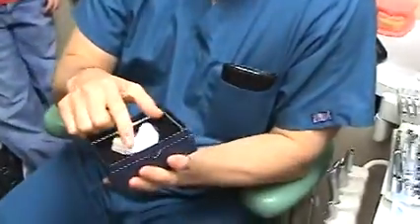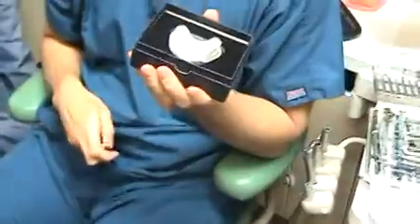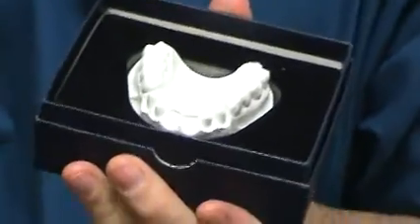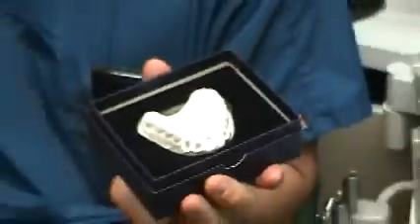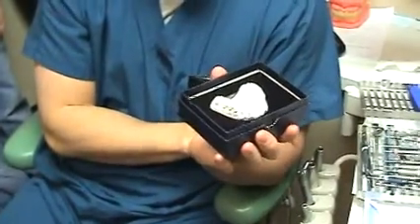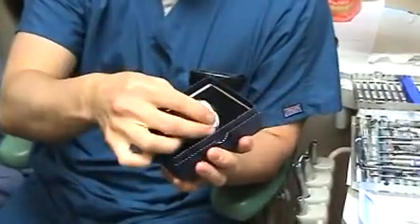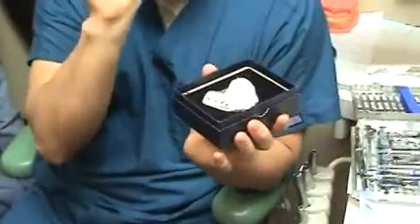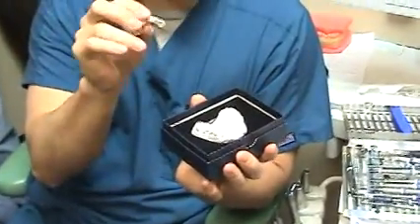The other thing for you to look at on here is, remember how I said when I prepare a tooth for a crown, I reduce the tooth structure in all dimensions, top all the way around? That's what crown preparations look like when I'm done with them. The front teeth are missing in this case, so we do a bridge to replace those missing teeth.